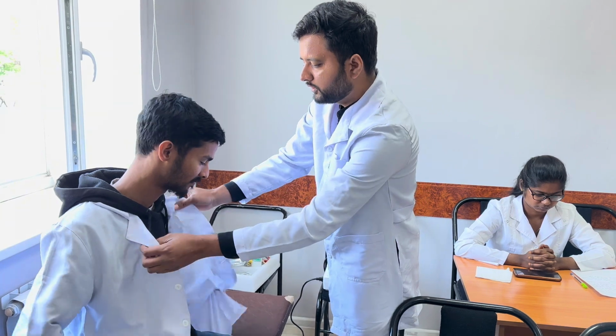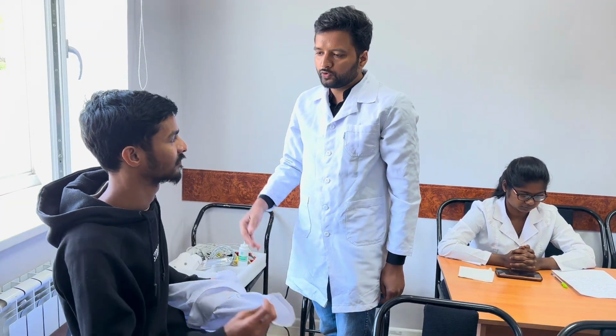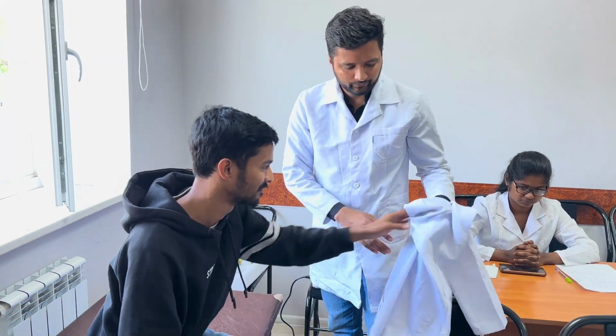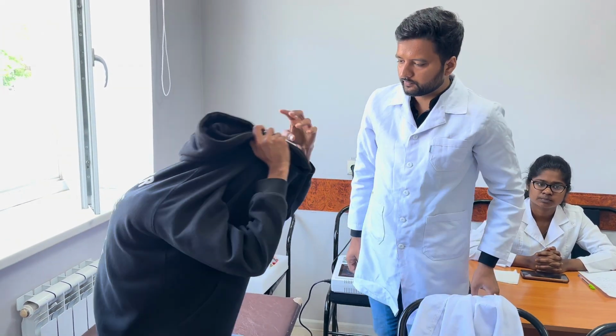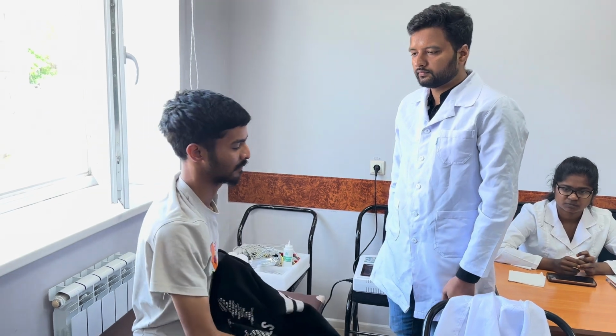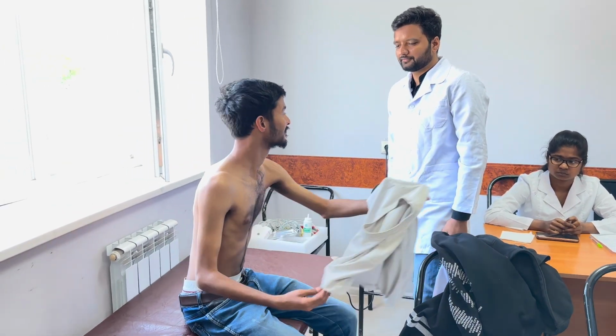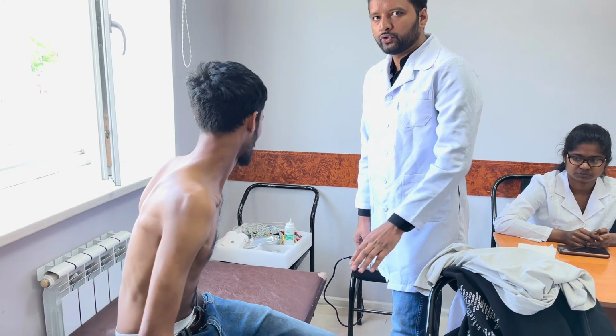Yes, remove. Okay. Get into supine position.